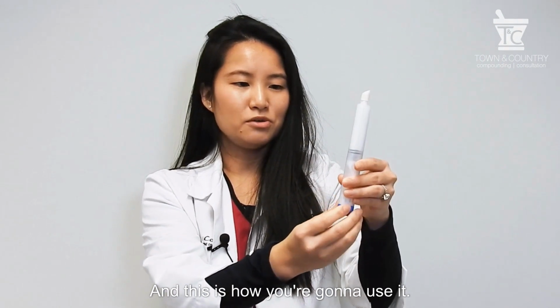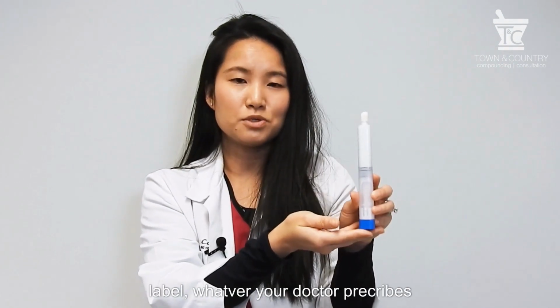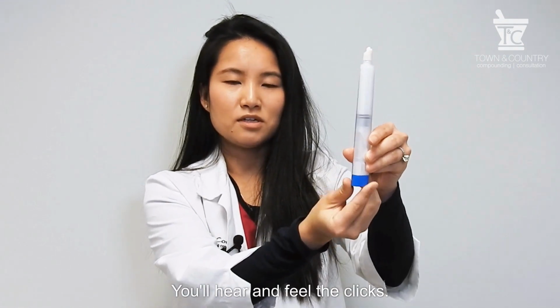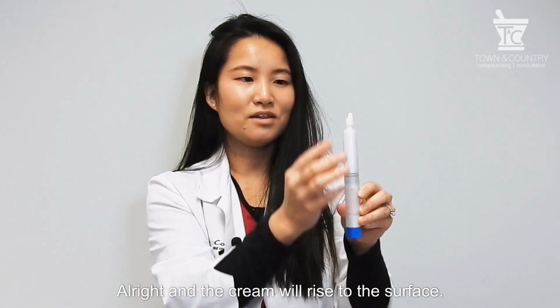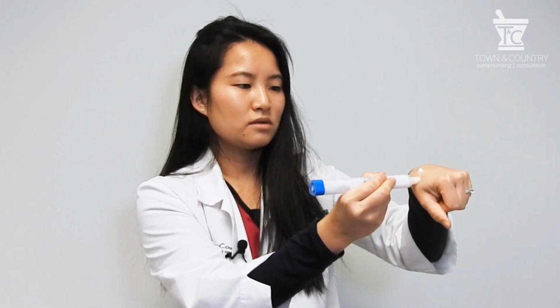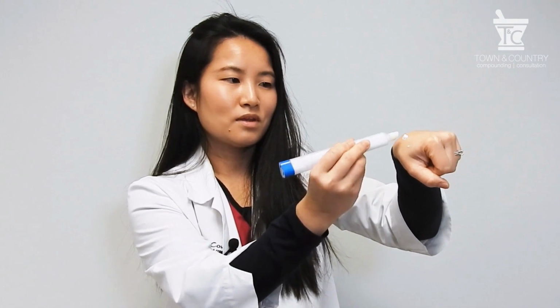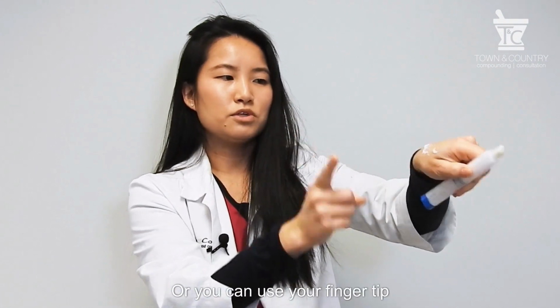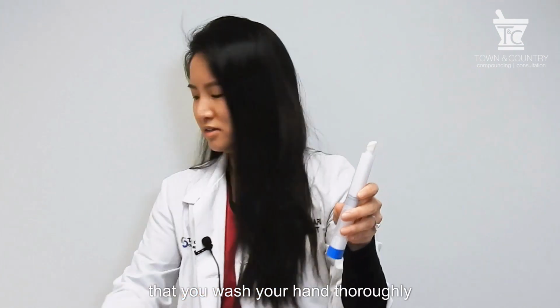And this is how you're going to use it. According to your prescription label, whatever your doctor prescribes, you'll know how many clicks to use. You'll hear and feel the clicks. All right, and the cream will rise to the surface. And you could easily just rub it in with the built-in applicator until it's absorbed completely. Or you could use your fingertip, but it's not necessary. If you do, make sure that you wash your hand thoroughly.